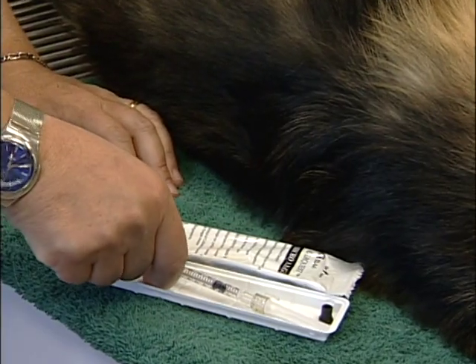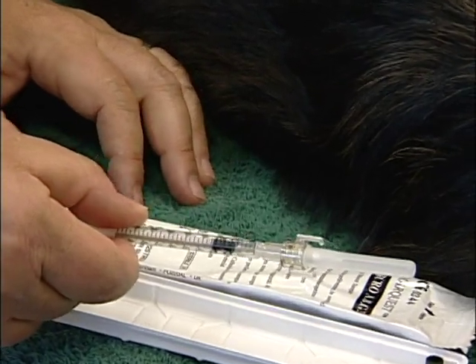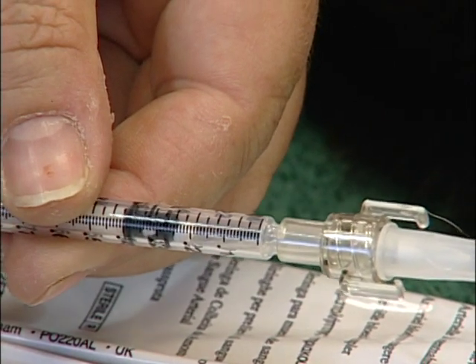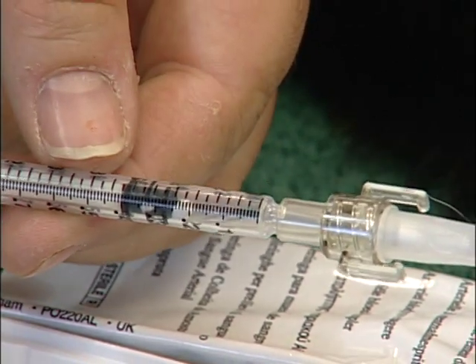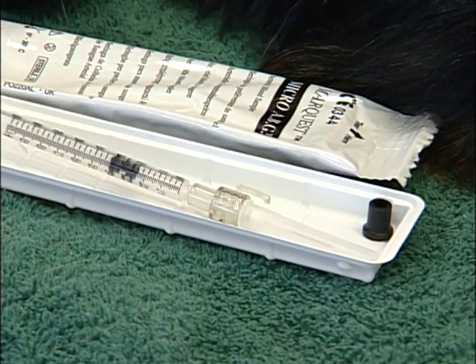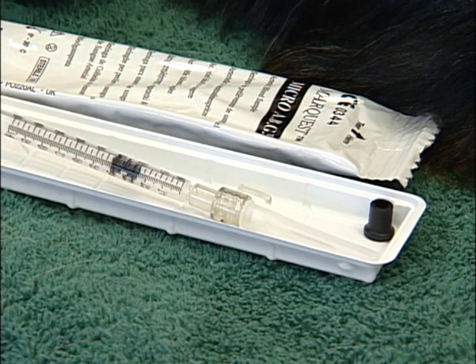This is a special blood gas syringe that makes obtaining an arterial sample really simple. The syringe comes already preloaded with some dry lithium heparin as an anticoagulant, and the stopper has an air displacement filter so that air can leave the syringe as blood enters it. The kit also comes with a small stopper to seal the sample after it's obtained, to keep air from entering in with the sample.